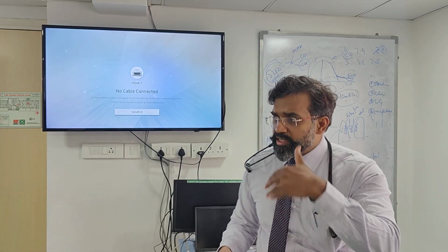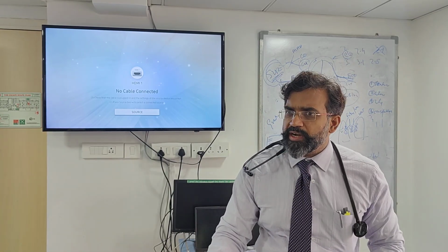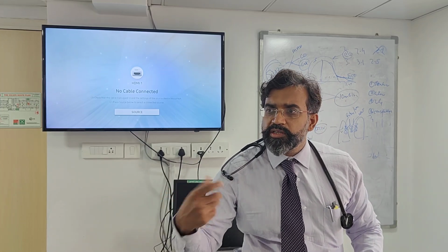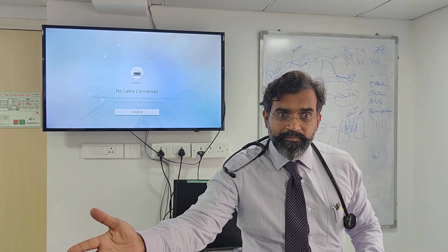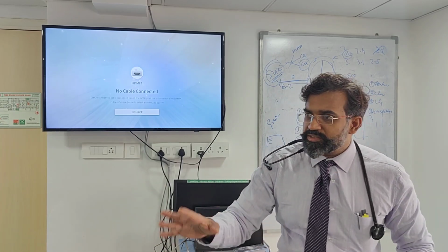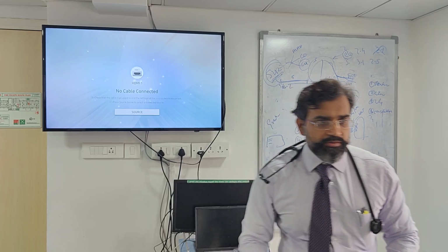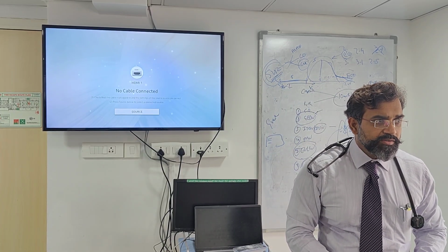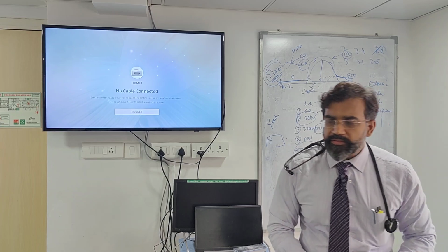So if you have an EVLWI that is high to begin with, of course I would not want to do that just to figure out prognosis. But say for example, a patient is on cardiac output monitoring and EVLWI is found to be high. You understand? Then the first thing would be what? Boss, this patient's prognosis is not very good. I need to act faster, more aggressively. Clear?